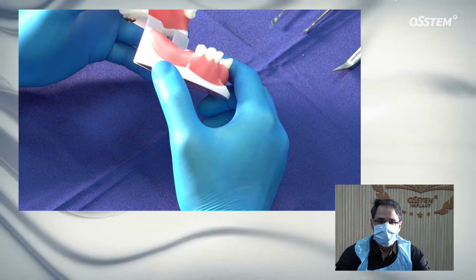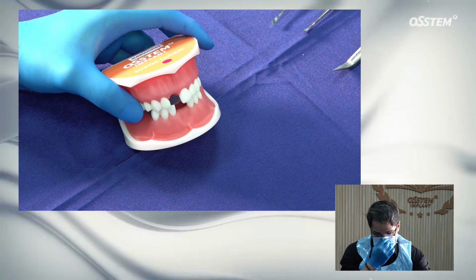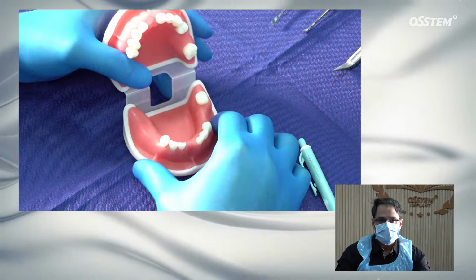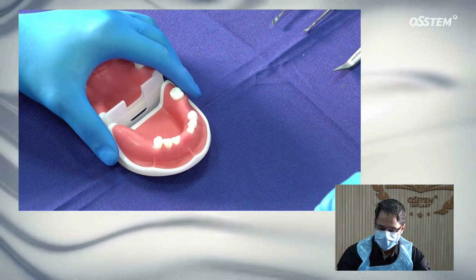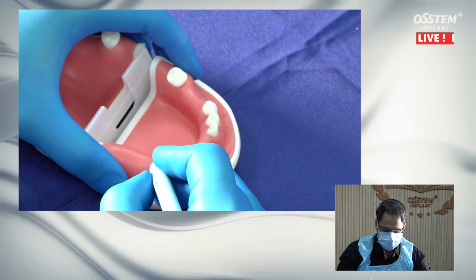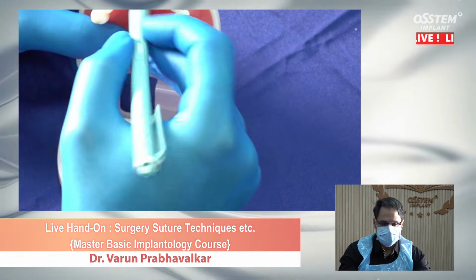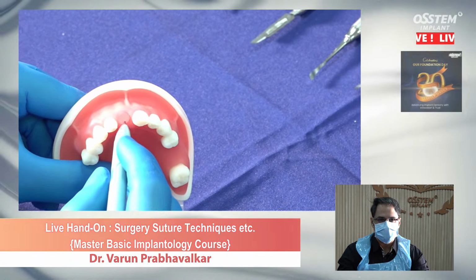The models we have in front of us are styrofoam models, okay? We are going to do two demonstrations, one for the delayed implant and one for the immediate implant. The choice for the site is going to be one over here, that is a premolar, and another one in the central incisor where an already existing socket is there.